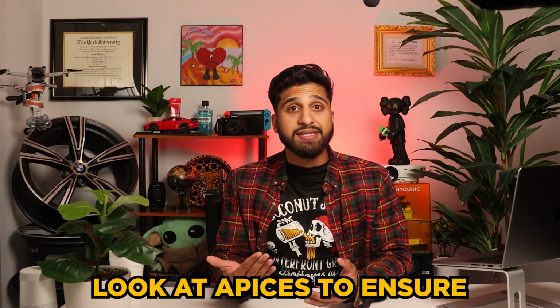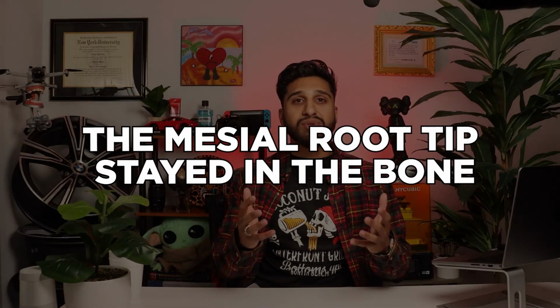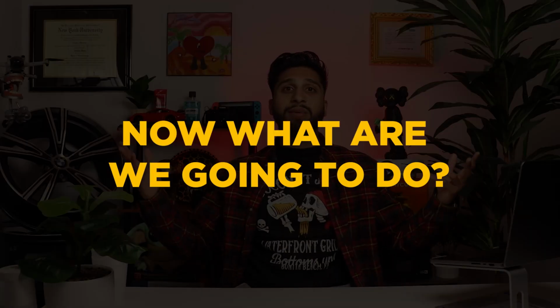So I have the tooth in my hand. I'm always looking at the tooth and its apices to make sure we got the entire tooth out. It's very important to examine that. And as I check it, I realize that the mesial root tip stayed in the bone. But with a good preoperative assessment, this should be anticipated based on the deflection of the root. Now what are we gonna do?